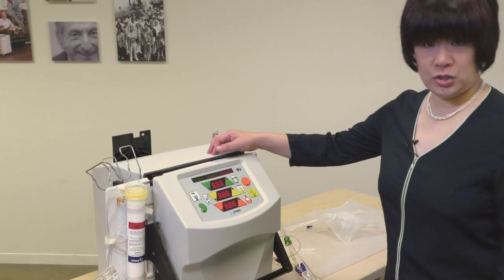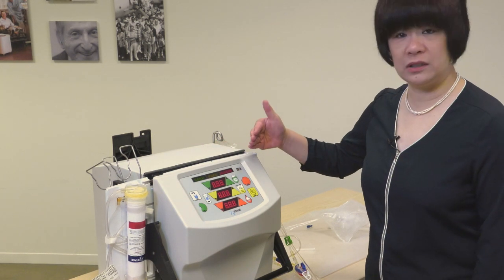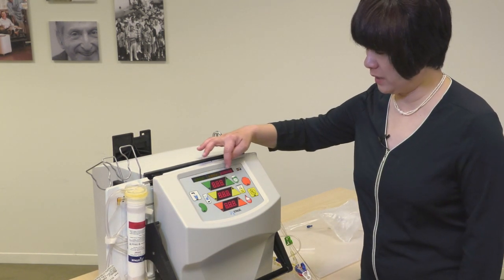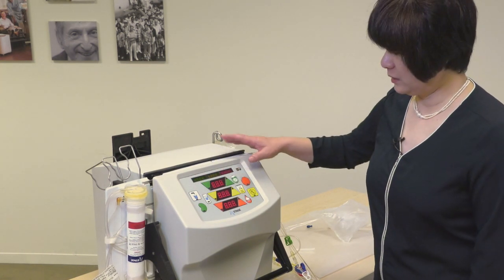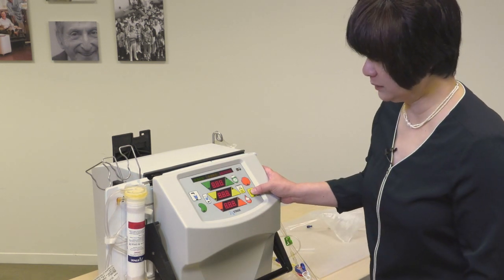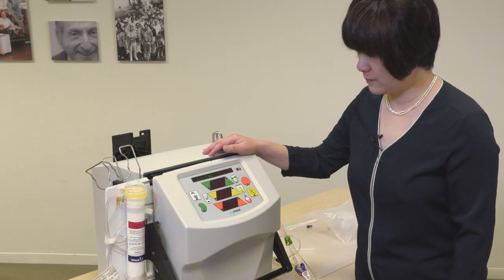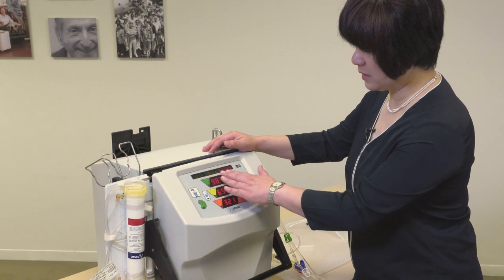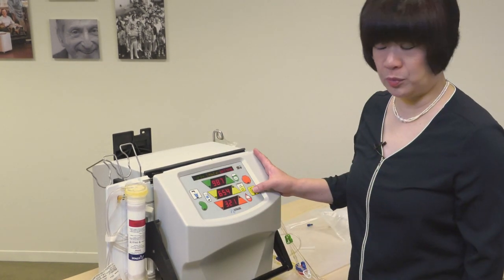After the initial phase of priming is completed, the machine will give us an alert. The user has to read all the display because this is a safety check. Then we acknowledge that we can read all the 8.8 dots by pressing the mute button. And then again, we have to be able to read all the numbers and the letters. After that, we can press the mute button.